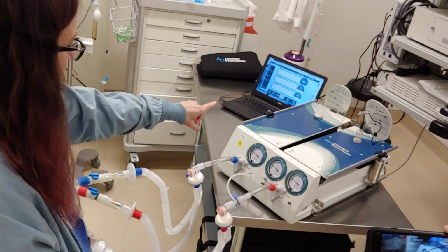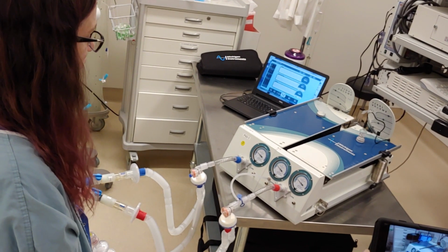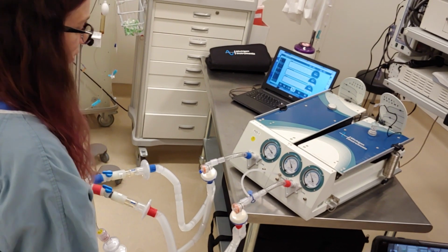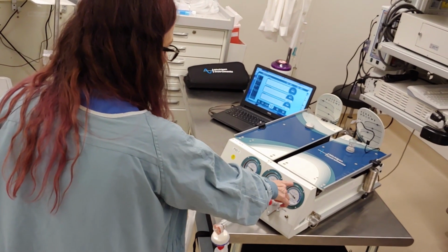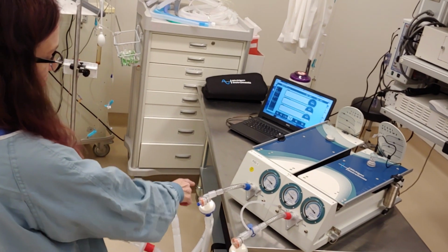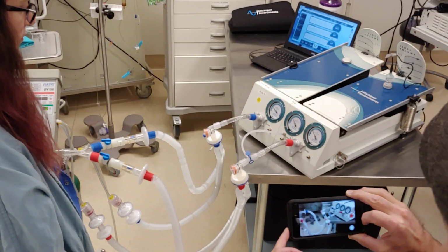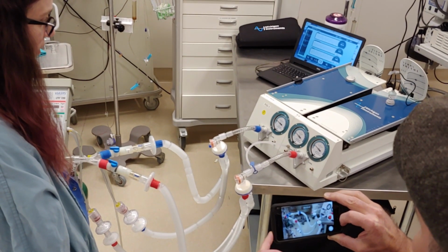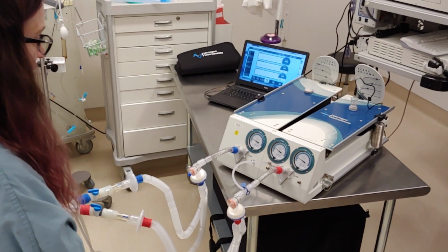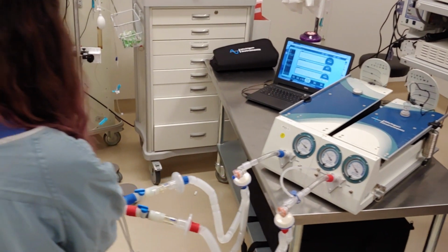This patient's so compliant that he's getting pretty big volumes just with 12 inspired pressure. Meanwhile, this patient, who's a sicker patient, is still getting 28 over 8, and this gentleman's getting 12 over 5. And if we need to put more pressure into this patient again, we can turn this up even more.